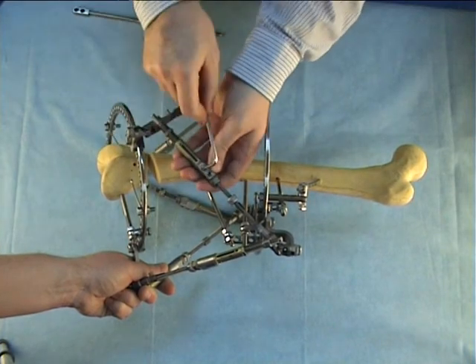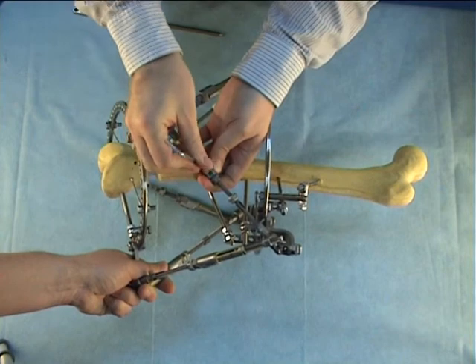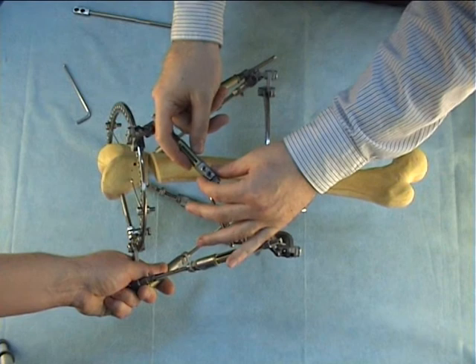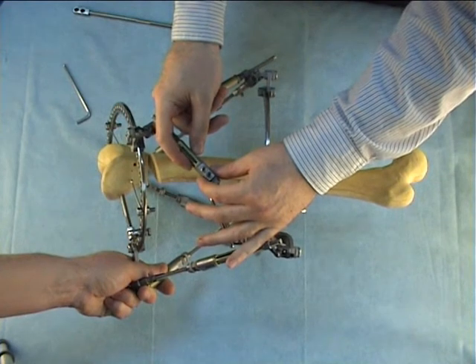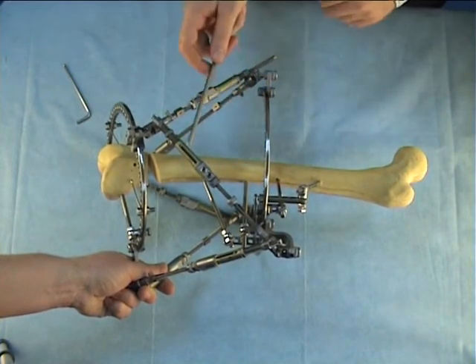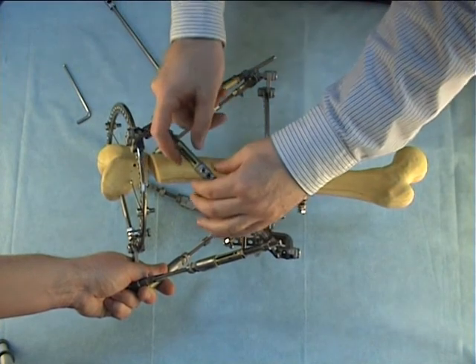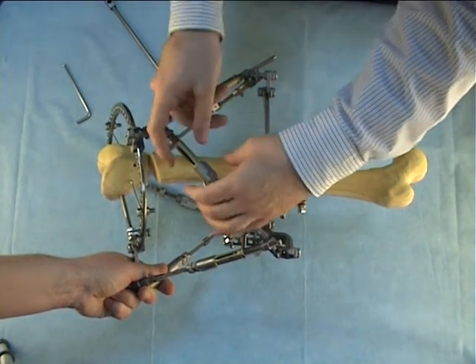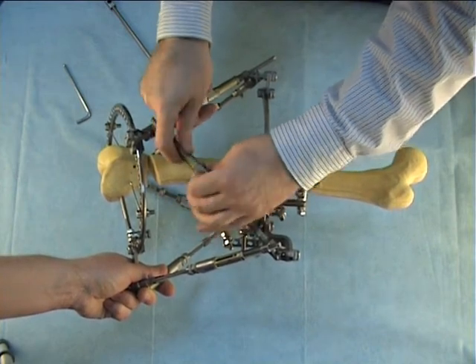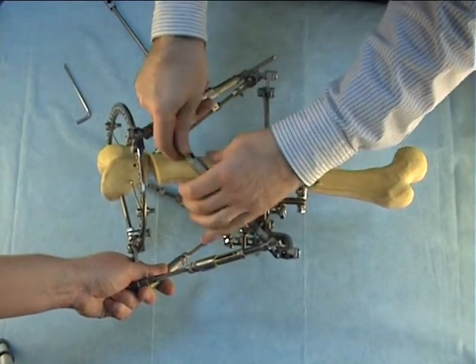We do it first, then by hand we move the lock nuts. Then we take the allen key and untighten screw number two, which is close to the yellow cylinder. Then in one hand we take the gray part of the strut's length changing unit, and in the other hand the yellow cylinder, and now we have to turn them to minus — yellow cylinder to minus and gray cylinder in the opposite direction.